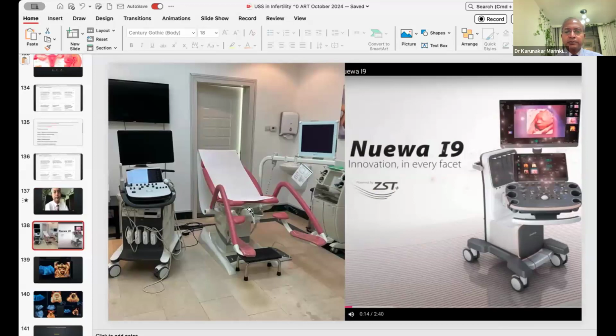You need to have perineal space. It's a crime if you're doing ultrasound on a school bench. I've seen a lot of people doing it, but they're happy about it. Patients are also happy. They're doing air gymnastics, keeping a pillow at the bottom, lifting their pelvis with their own hips. People think it's laughable, but you will never scan the anterior compartment of the pelvis without space for the handle to depress below the level of the rectum, below the level of the anus.